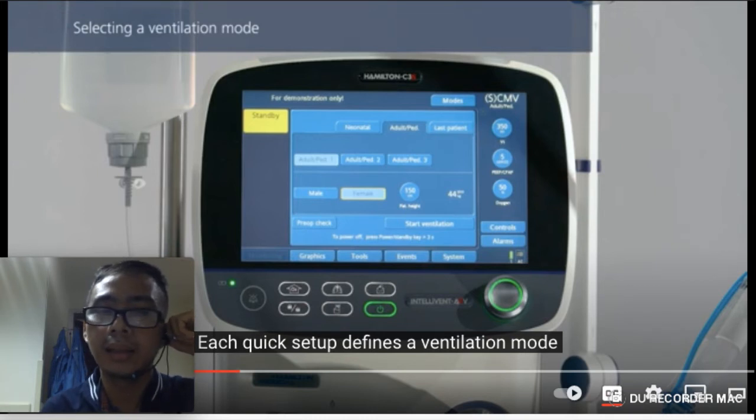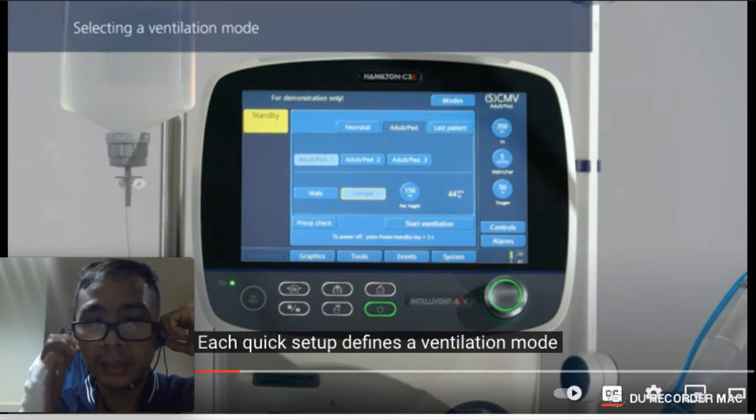nag-interpolate sa ARDS, which is conservative or protective lung ventilation, which is 4 to 6 ml per kilograms, and then for COPD, which requires higher tidal volume. So ma-observe mo yan. You can contrast your manual computation based on a computer computation of your ventilator na nag-automatic, nag-input ka lang sa modern ventilator, but considering mali pala yung predicted values ng ventilator.